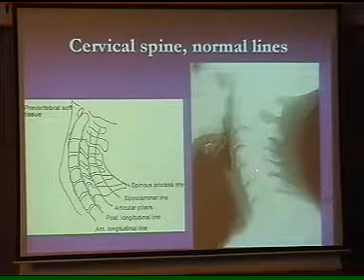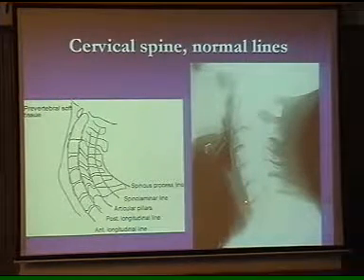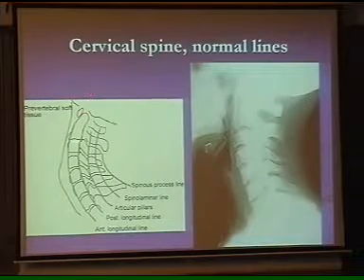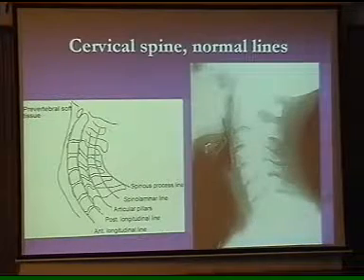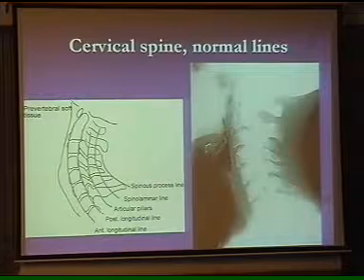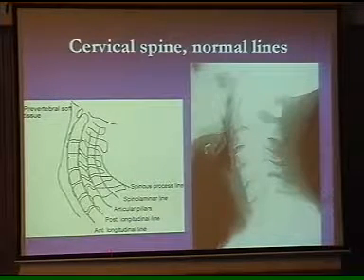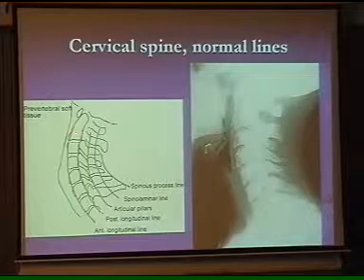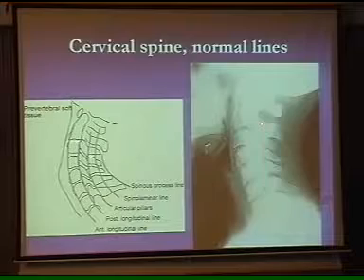Similarly, if you are suspecting some trauma over here, the space may be normal because there is no infection and no hemorrhage over here, then look for these lines. Look at this, known as the anterior longitudinal line, that runs just anterior to the vertebral bodies. They all should come in line. If you connect the vertebrae together, there should not be any distortion or disturbance or any wavy pattern. It should be on one line. Similarly, the second is the posterior longitudinal line, just behind the vertebral body.